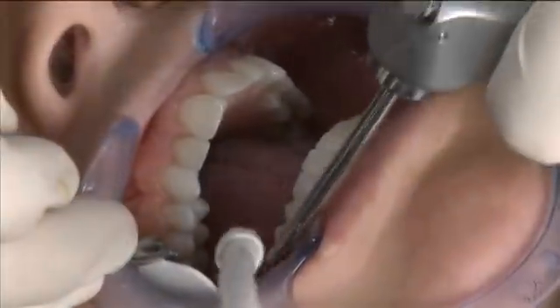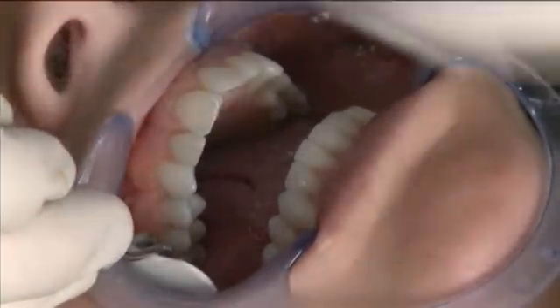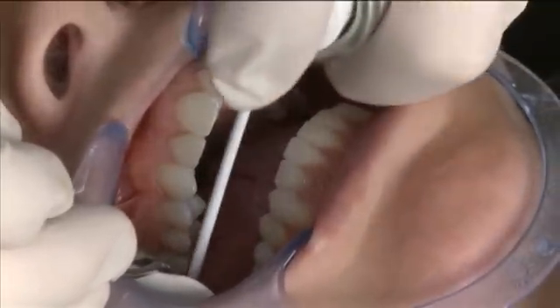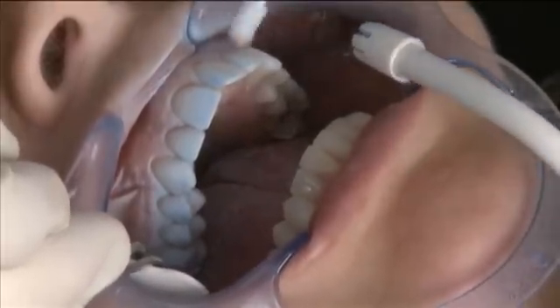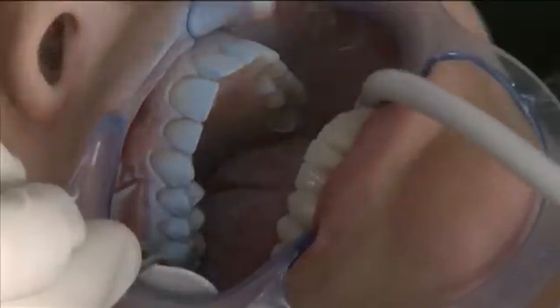Now we're going to do the other half of the arch by drying it and repeating the powdering process as before. We've got a dry angle in place. We're going to start at about a 45 degree angle to the buccal, spraying a light coat of OptiSpray all the way across the midline again. This is followed by a light coat across the lingual.